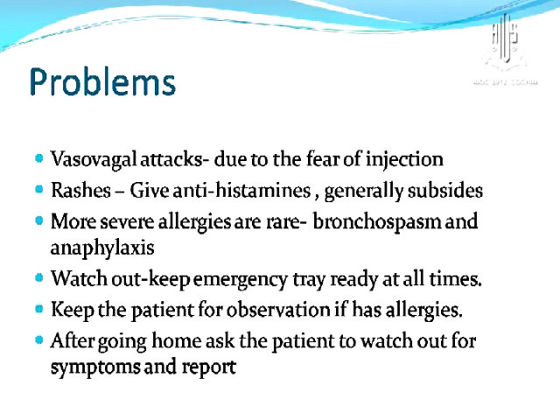steroid or anything. See if you can avoid giving it in the same cannula, because now there is fluorescein dye in the scalp vein. So you inject it, you are again injecting fluorescein dye. At that situation, when it is mild, generally the patient is not collapsed, you can always give it in the other vein. This scalp vein is kept so that when the patient has a severe reaction, you will be able to start an IV line and start the other drugs.